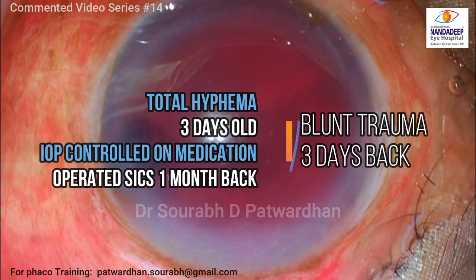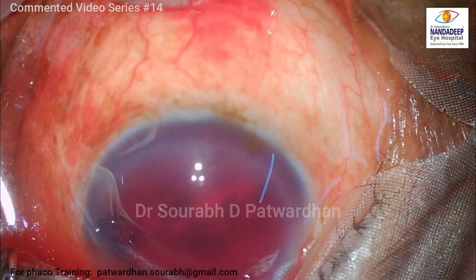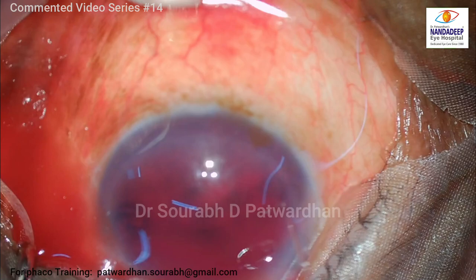This patient had blunt trauma three days back and has a history of operated small incision cataract surgery a month back. At present, the IOP is controlled on maximum oral and topical medication. But as you can see, the hyphema is total and we have to wash it off to hasten the recovery.